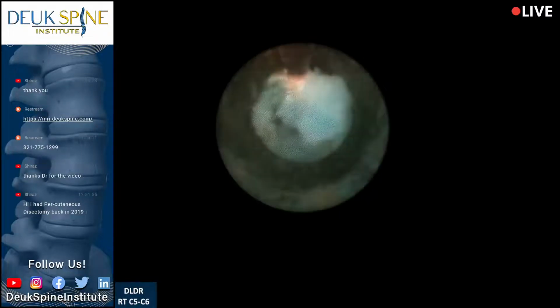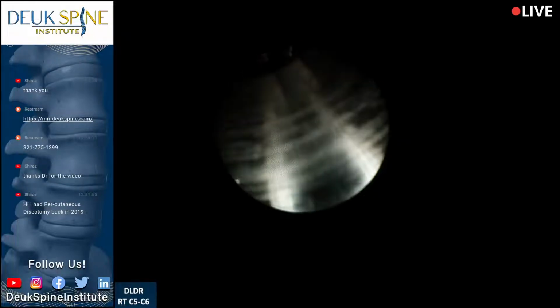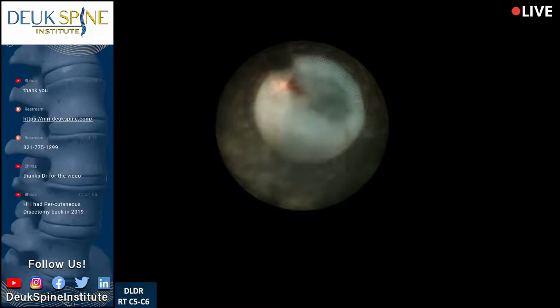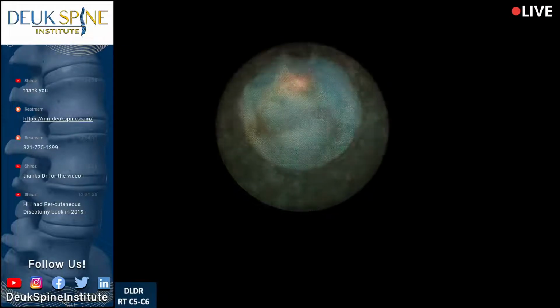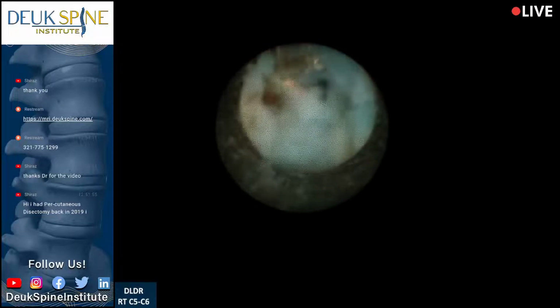There's another piece of herniation right there. So whenever the original traumatic injury occurs, you get a tear in the posterior wall of the disc, and then you also get a smashing of the nucleus, which is the cushion. There's a big herniation right there, right in the foramen on her right.